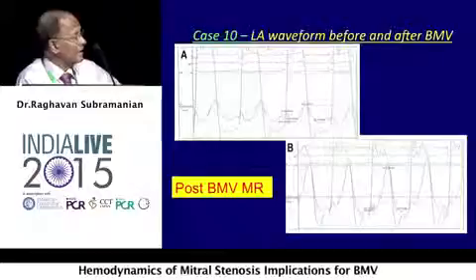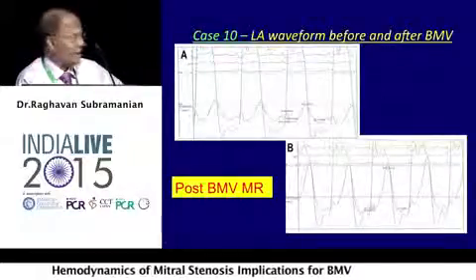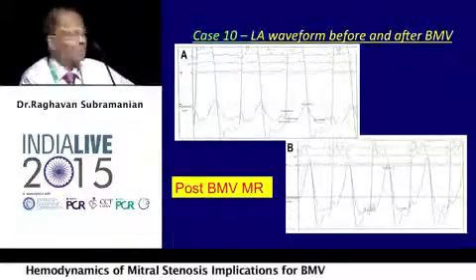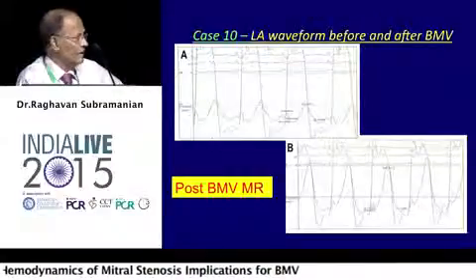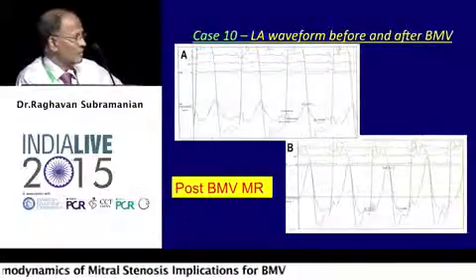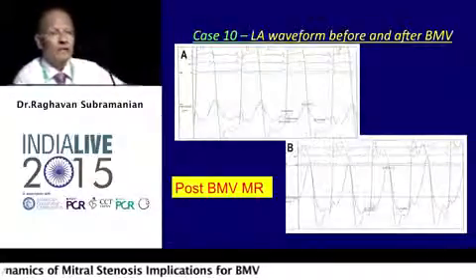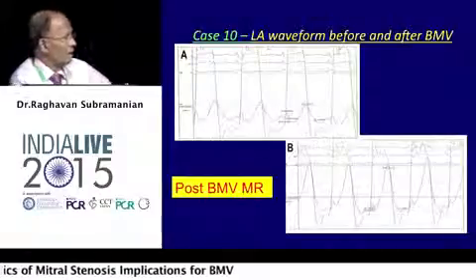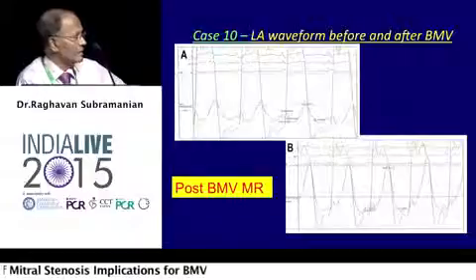Yes, classical mitral stenosis, typical man. Now the V wave is large, but you are worried when the V wave becomes even larger after you dilate the balloon. Here you see the V wave has become Himalayan, almost 2/3 of the LV systolic pressure, and it tells you that you have probably torn something and produced mitral regurgitation. Therefore, again, as I said, hemodynamics are useful for identifying complications.